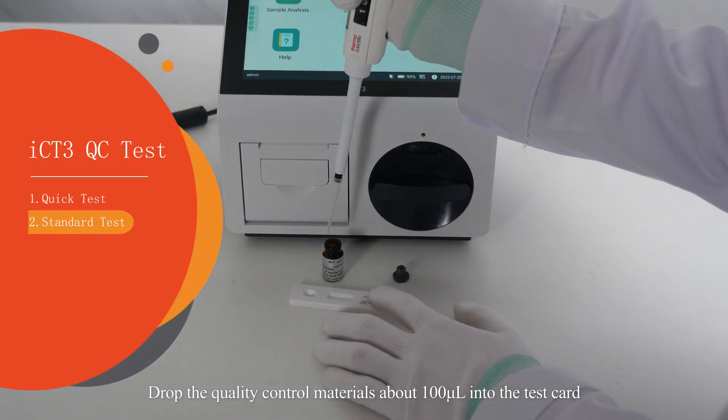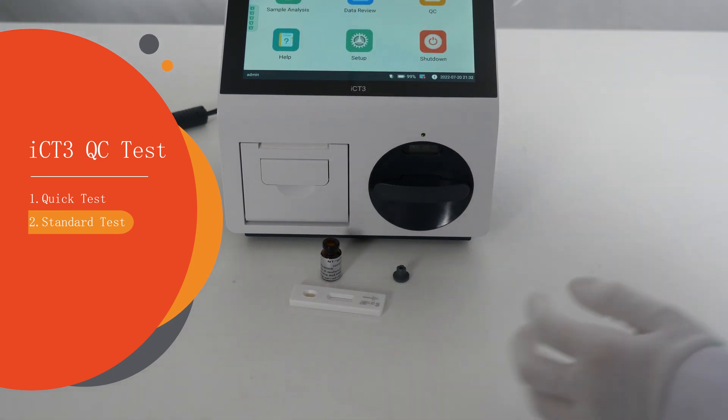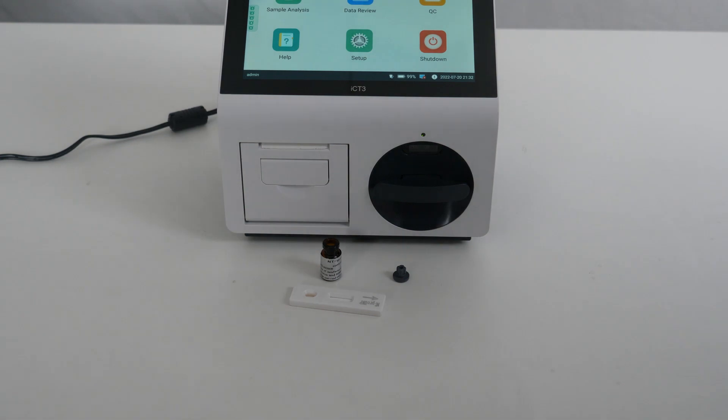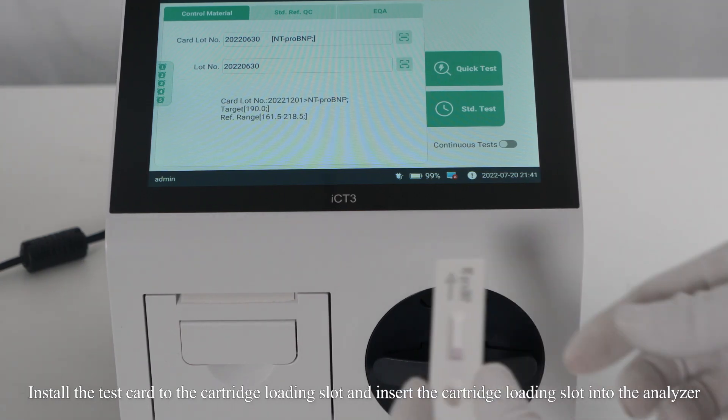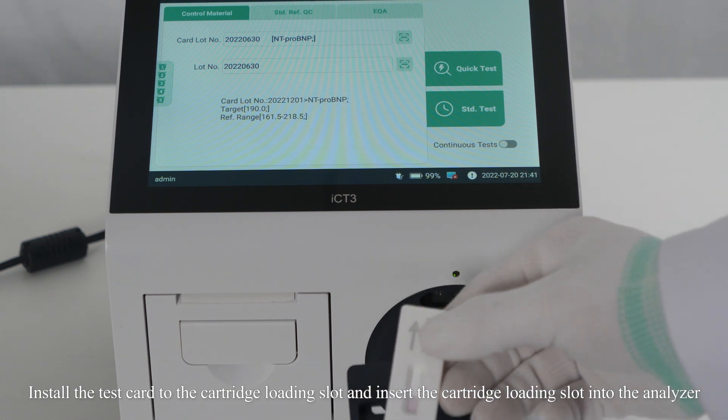Drop the quality control materials about 100 microliters into the test card. Install the test card to the cartridge loading slot and insert the cartridge loading slot into the analyzer.